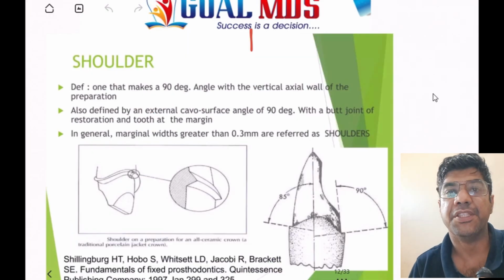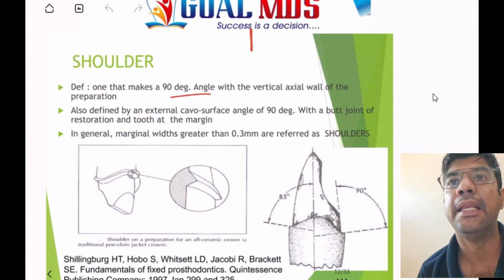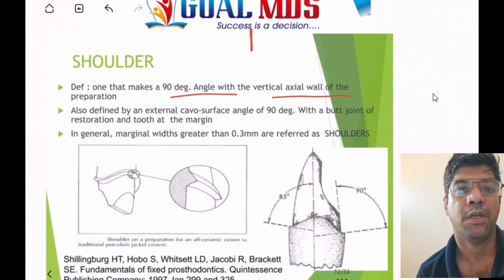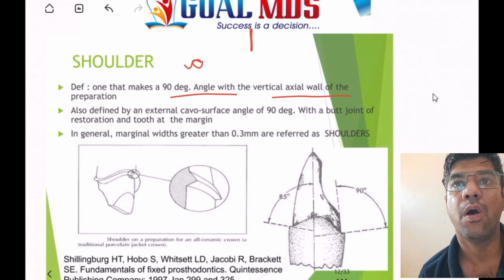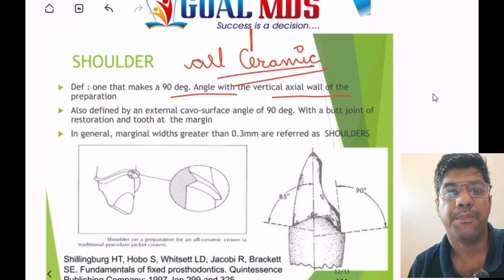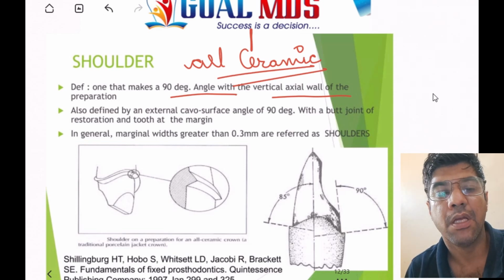The next is the shoulder. A shoulder finish line is one that makes a 90 degree angle with the vertical axis of the preparation. So remember, shoulders are preferred for all ceramic restorations, ensuring adequate margin thickness for the structural strength.